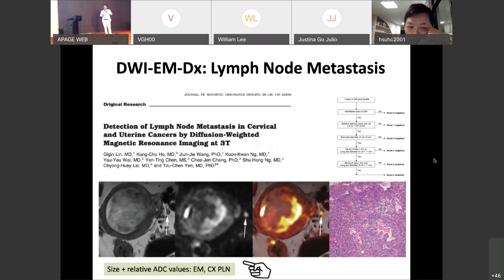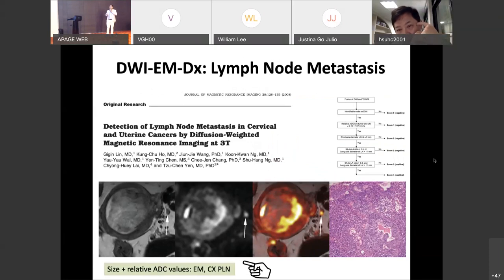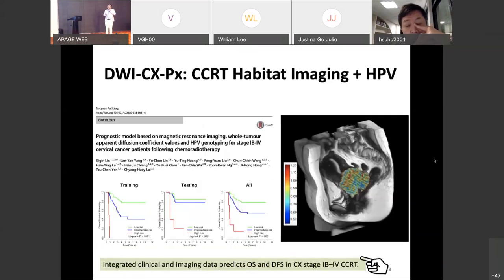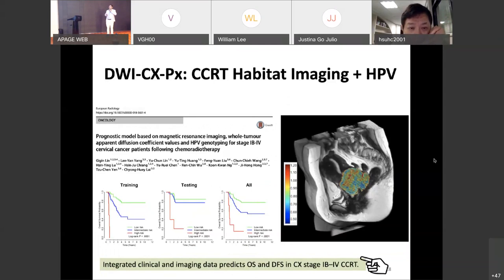After differential diagnosis, the next important preoperative imaging task is identifying lymph node metastasis. Diffusion weighted imaging plays a very important role here — for example, in endometrial cancer with left external iliac lymph node metastasis, we can identify a very small lymph node containing cancer cells at a size of only 6 millimeters. Nowadays MRI has moved on to what we call habitat imaging: by analyzing all pixels on the MRI we can identify the highest-risk clone within the tumor, identify different levels of cellularity representing tumor heterogeneity and differential treatment response, which may require a higher dose of treatment.